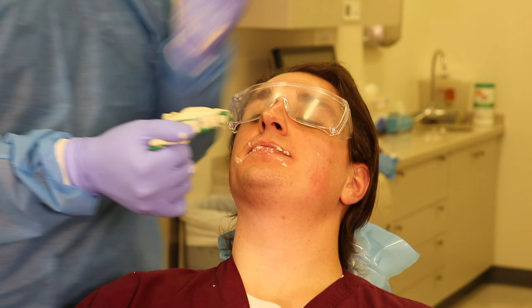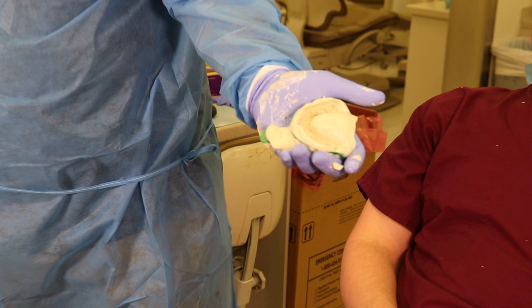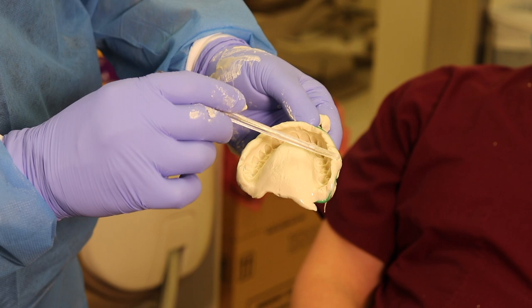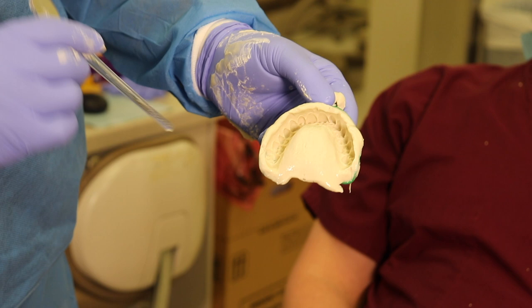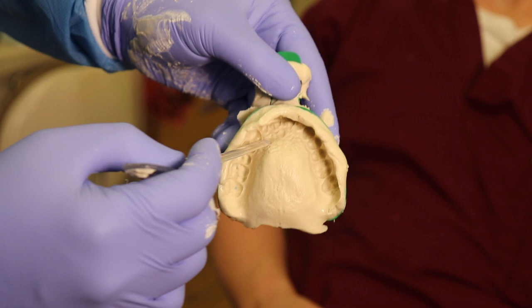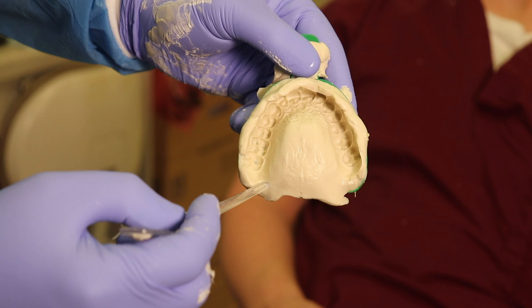And what am I looking for? Do you get a good shot right there? Mm-hmm. Okay. What I'm looking for on a good impression is that I get material all the way up to the deepest portion of the vestibule. I copy all the teeth free of bubbles. I copy all the palate, okay? And I get not so much excess in the back. This is what I call a pretty good impression. Okay?